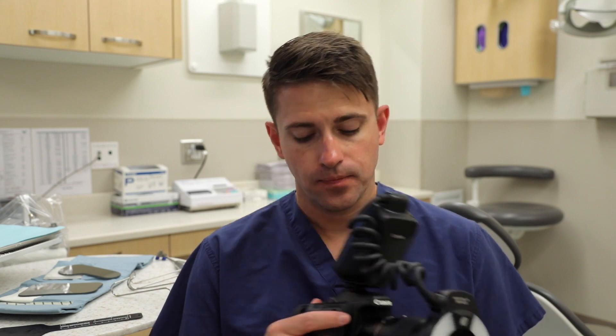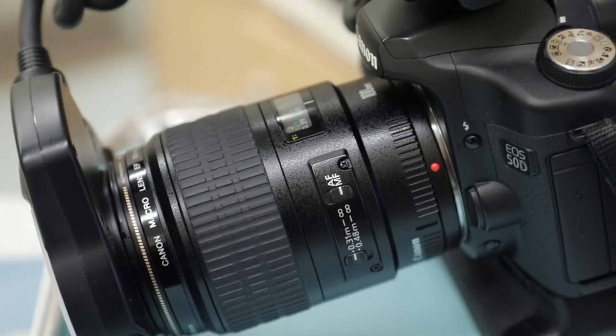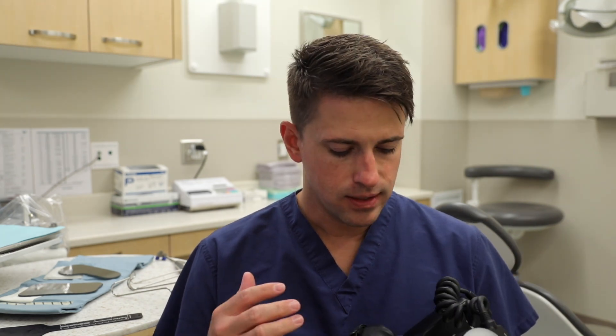Today we're going to talk about some of the things you will need if you're going to do clinical photography on your patients. First and foremost, you're going to need a camera. I recommend using a DSLR camera like this one, where you have a separate body, a separate lens, and in this case we have a ring flash mounted to the camera. This is a Canon — I know there are a lot of Nikon users out there as well, and either camera is going to be fine.